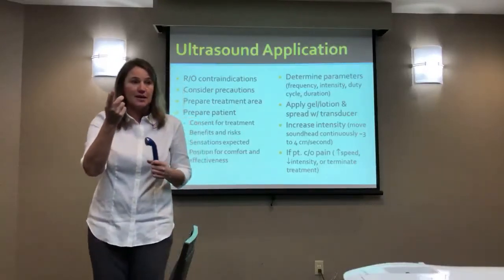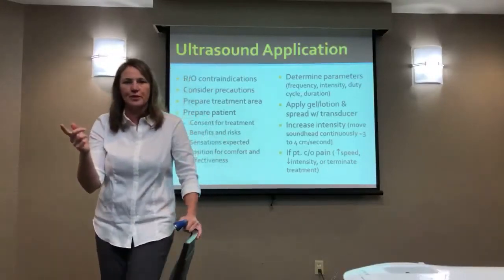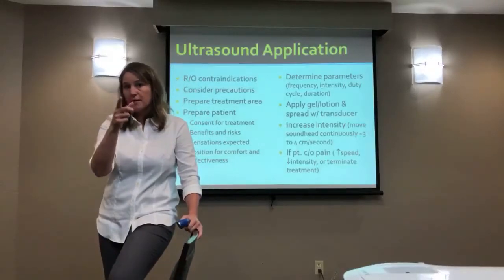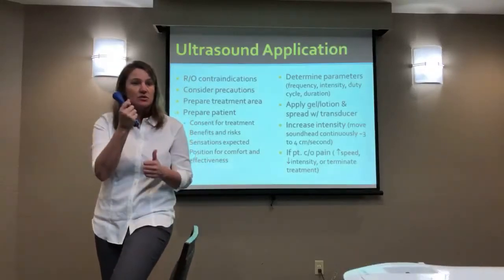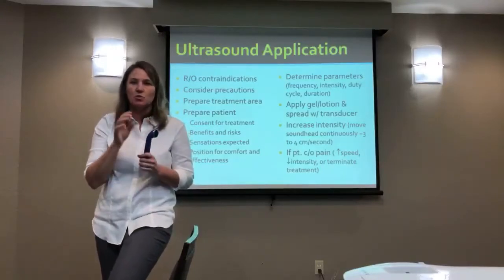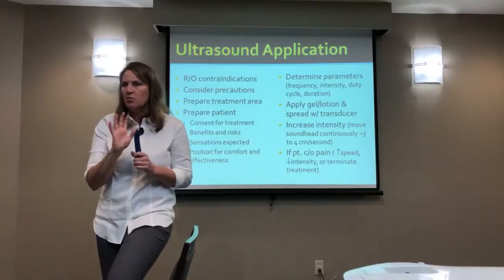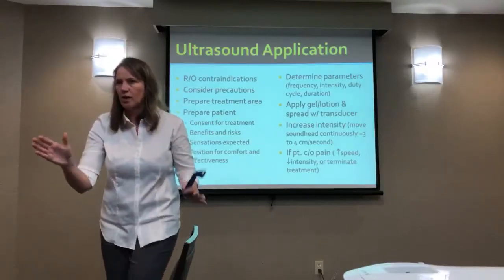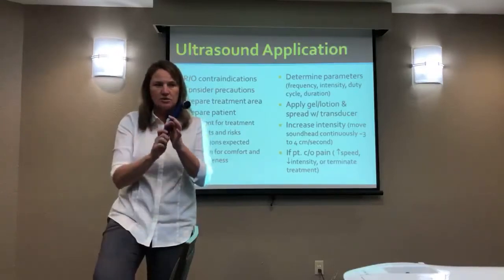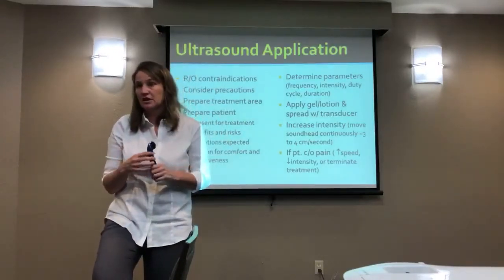Now, that's what I'm using back here, more to protect you guys from the person next to you's cold that they're brewing or the flu that they're coming down with. Where I'm worried about that is the face of the machine and the handle, because each of you is going to touch it and rub your nose. That's more likely how you're going to transmit illness to each other. So for me, it would be more globally wiping down the whole machine, the knobs that you've touched, the handle, the wire, anything that you potentially could clean.